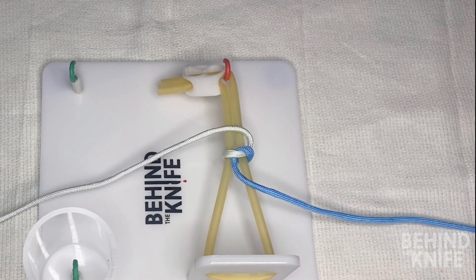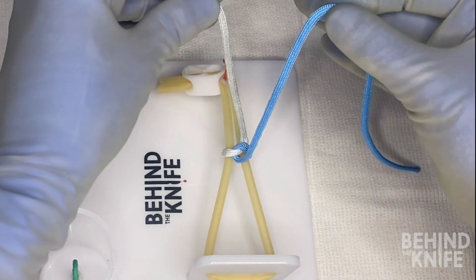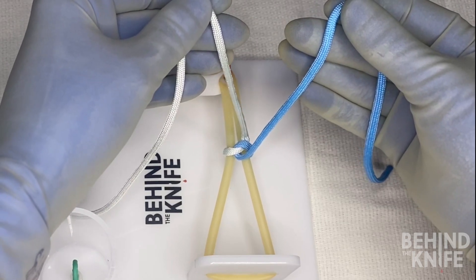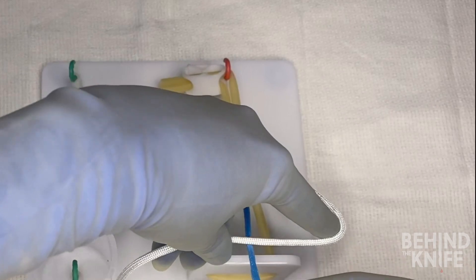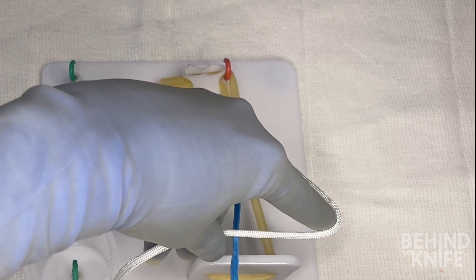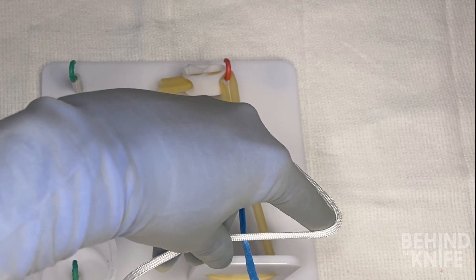Now this is just one half of our knot. In order to continue throwing square knots we'll have to switch to making fours, and I'll show you what that looks like. To start, you'll pick up the same side of the string with the same hands as before, and using my index finger I'm going to bring the white side of my string over top the blue side to make what almost looks like a number four.